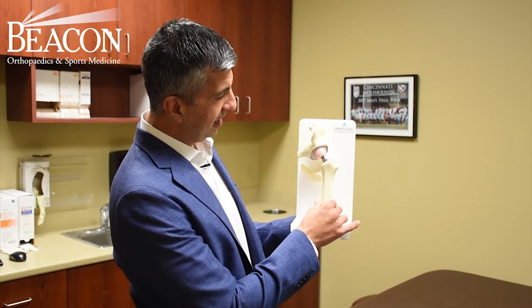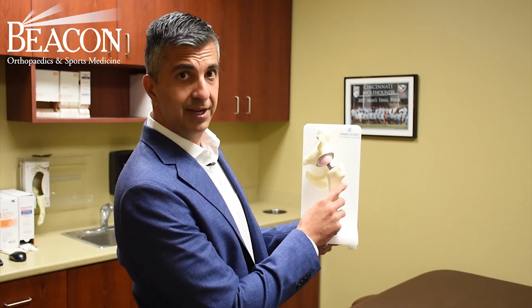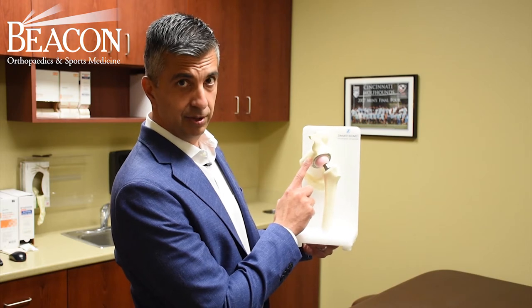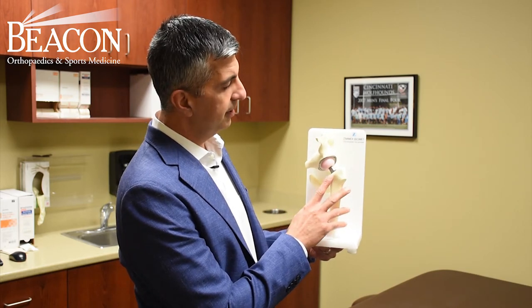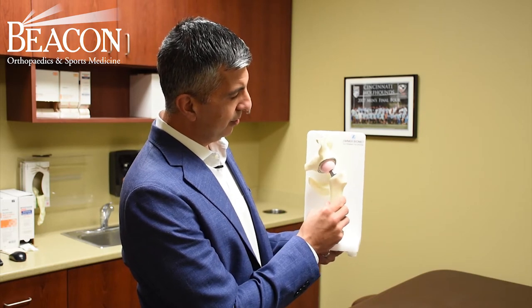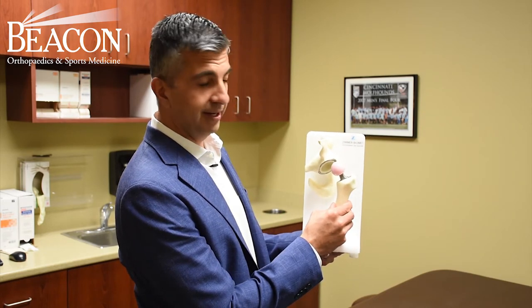This is your basic hip replacement. You have two main components: a femoral component and an acetabular component. People would say perhaps a ball and a socket. The femoral component that we commonly implant is made of ceramic.